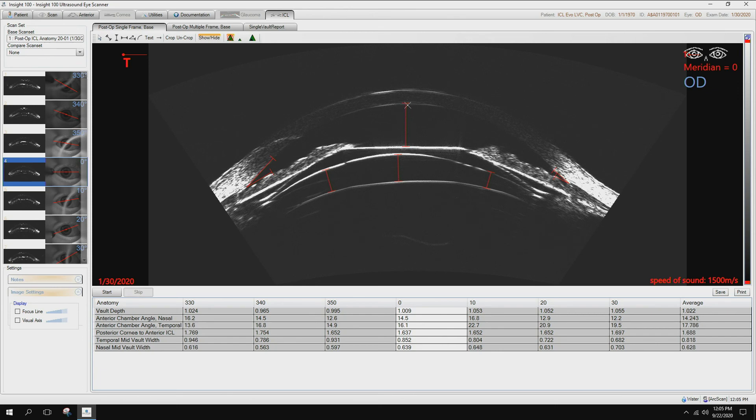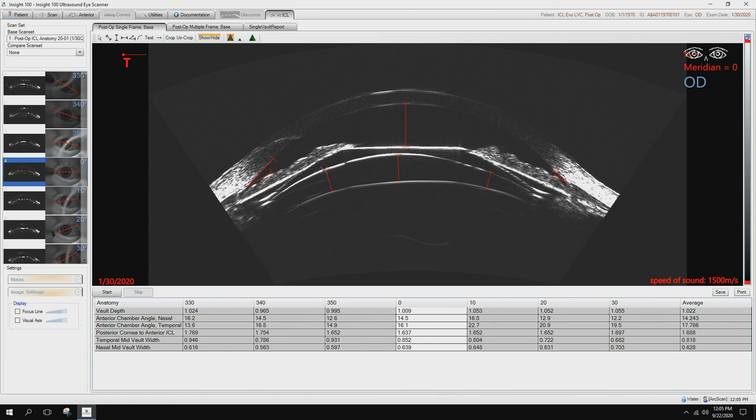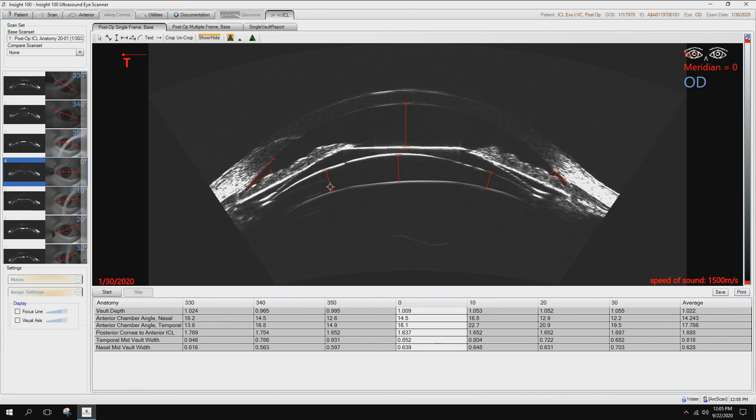We're taking measurements of the depth here. This is central vault, and more importantly, especially in the high myope patients, we want to have a mid-periphery vault, so that is back here behind the iris. OCTs are not going to be able to get back here to see that.